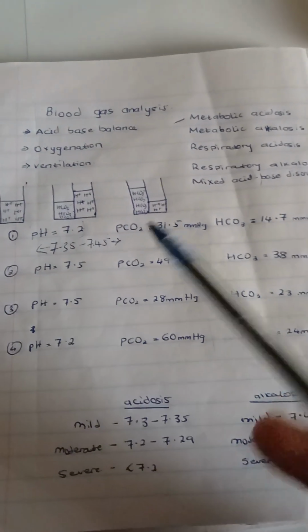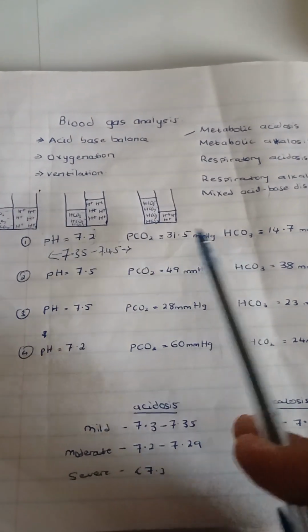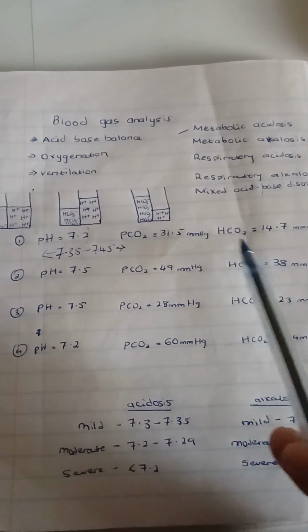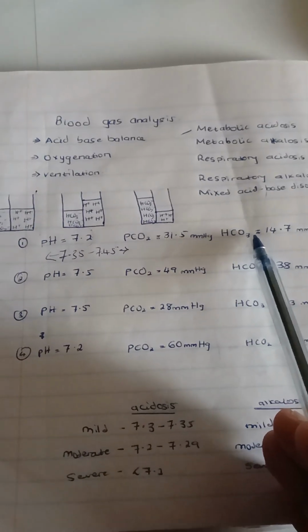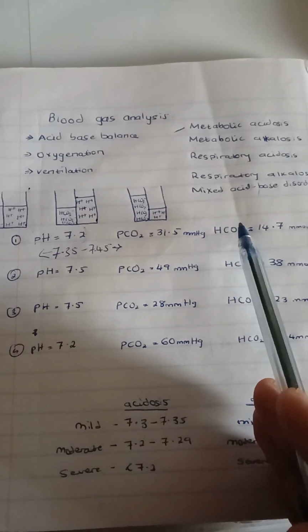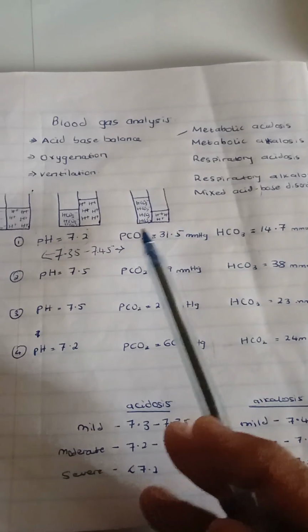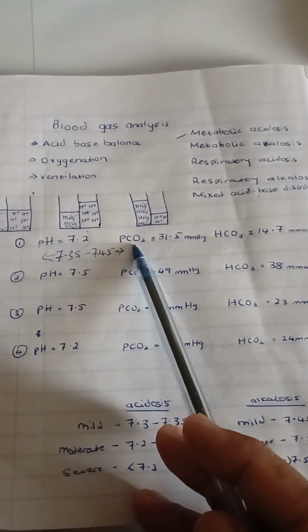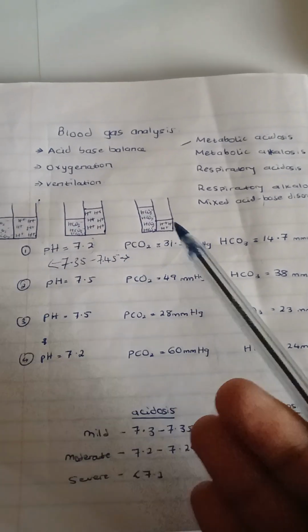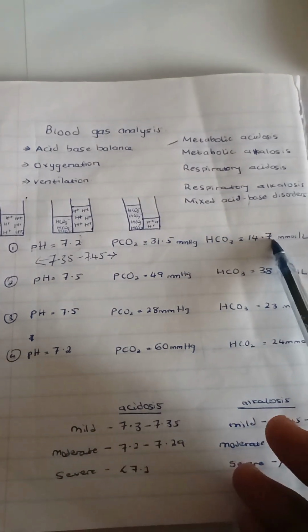This can be answered by looking at these 2 parameters, the PCO2 and the bicarb. Basically, these two parameters are telling us the equality between the acid and base. Bicarb is a base and PCO2 is an indicator of the acid, because we know carbon dioxide, when it dissolves in water, forms carbonic acid. So PaCO2 is an indicator of acid and bicarb is an indicator of base.